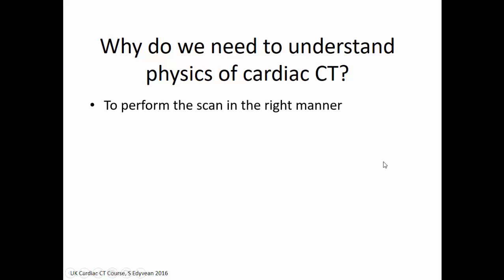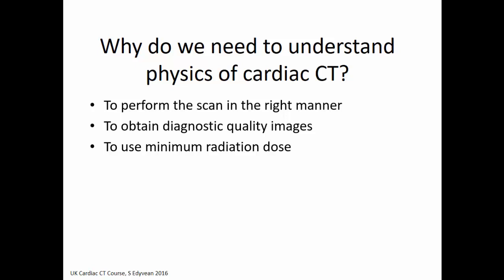So firstly, why do we need to understand the physics of cardiac CT? I'm sure a lot of you threw it away perhaps many years ago, although I think if you're interested in cardiac CT, then you're interested in technology and physics to some extent. But it's mainly to enable you to understand how to perform the scan in the right manner. It's also so that you can have some idea about how to obtain diagnostic quality images and not just rely on the manufacturer and the settings on the scanner. It's also to enable you to use as little radiation dose as you need.